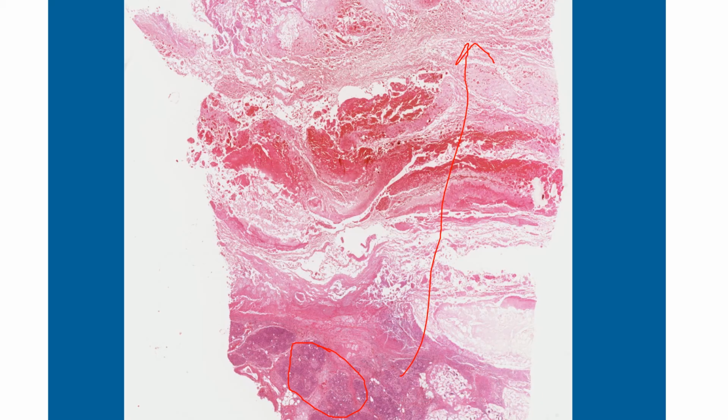So this is necrosis of the pancreas with areas of hemorrhage. Those are the pictures of acute pancreatitis, and this loss of pancreatic tissue is basically due to autolytic digestion of the pancreatic tissue.